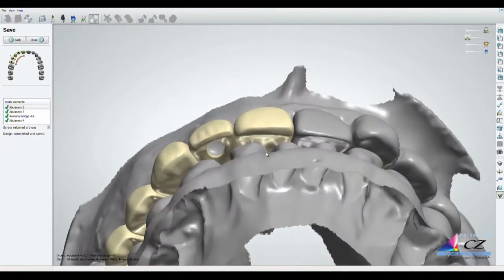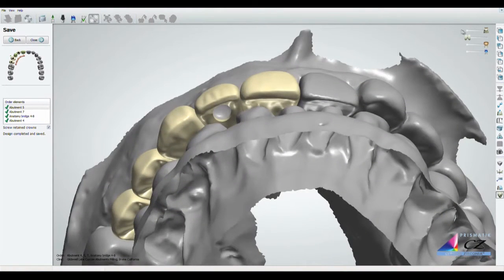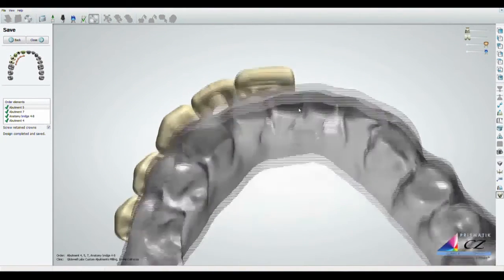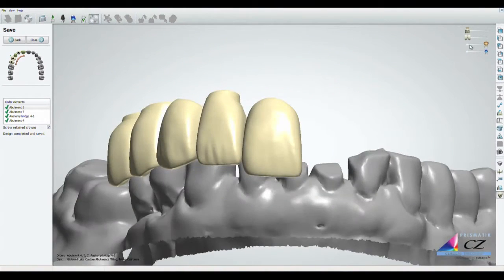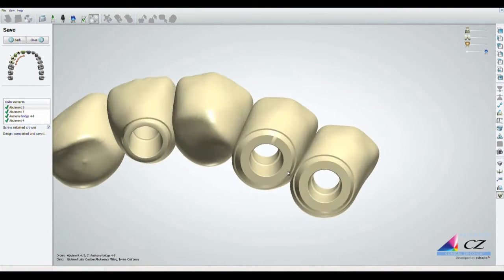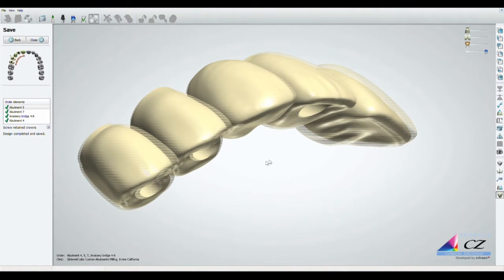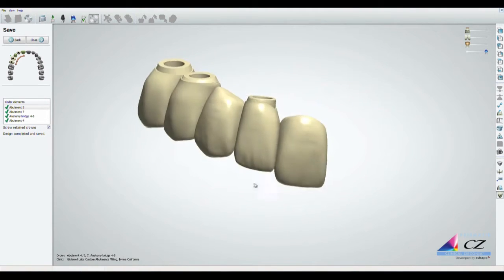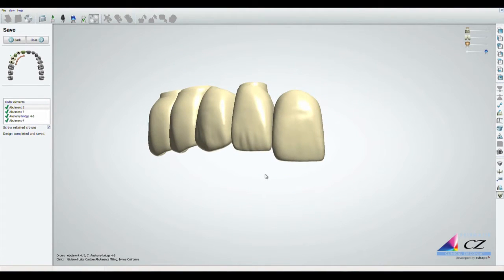Then the technician determines the locations of the access holes for the titanium copings. The data generated from the scanning abutments is very important when it comes to positioning the openings in alignment with the implants. The access holes are created with the proper dimensions needed to accommodate the titanium copings and are situated to ensure a passive fit of the prosthesis.